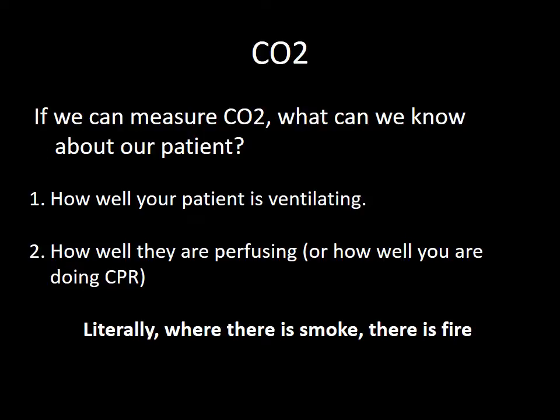So one little thing that I didn't tell you was that kapnos in Greek is smoke, and if you think about it, carbon dioxide is a byproduct of metabolism. So literally, if we can detect the smoke, there is fire. So when we're doing CPR, if we're getting good capnography or good CO2, we have not only good perfusion, but we also have metabolism occurring in your patient's cells.